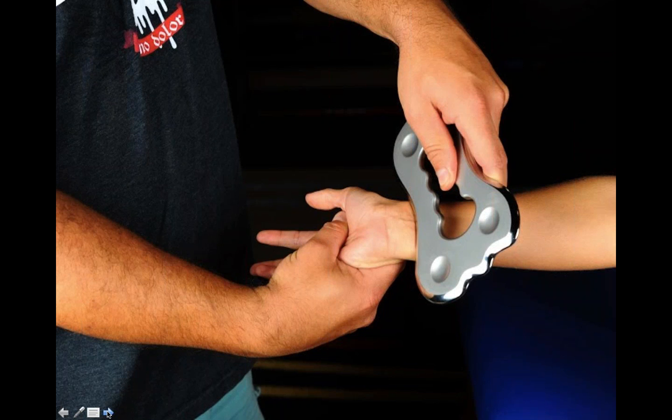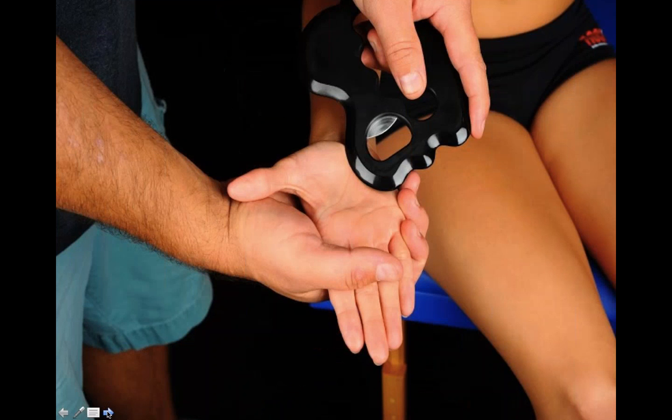So here are some ideas of how we hold a tool for the feathering effect. Very light. You can see the clinician's hand is very light on the tool, and we like to use this as an example for the patient so they feel at ease.